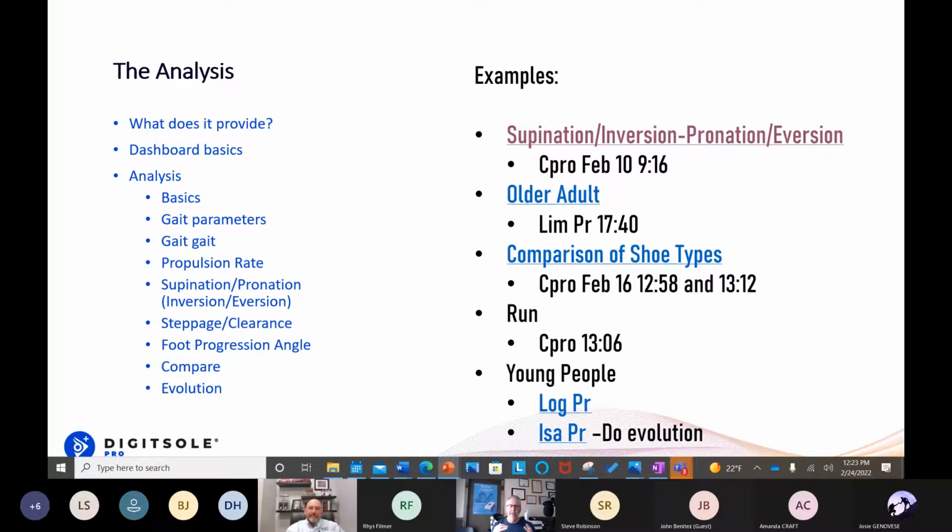And then from the analysis, it shows me, across the top, one of the most basic things, which is going to be symmetry with regards to how the patient is actually moving. And then it has a breakdown of the basic gait parameters, which again, I think these are the things that everyone remembers from school when they were taught basic analysis when it comes to gait evaluation, and probably some of the things that we may try to replicate in a clinic, either with some grids on the floor, things like that, which obviously is a little bit more qualitative than just looking at them.